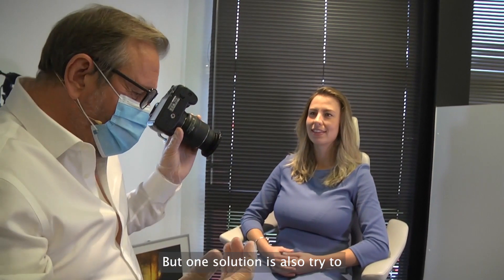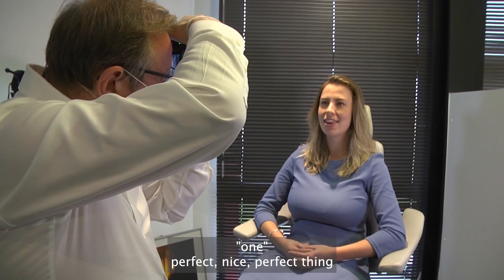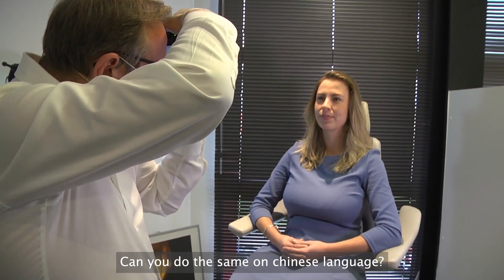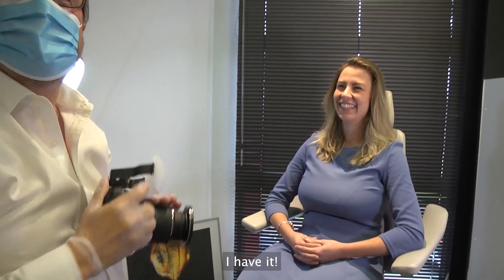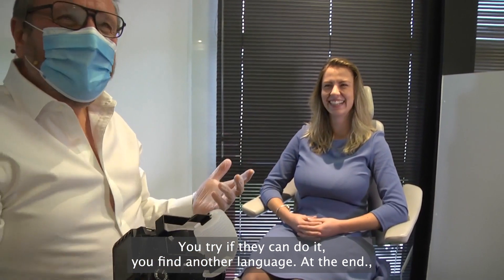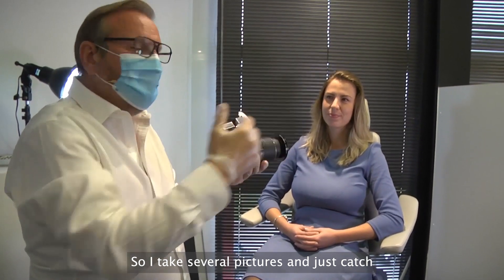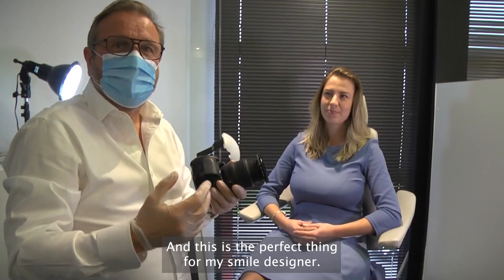One solution is also to try to count down from nine to one. Can you do the same in the Chinese language? If they can't do it, you find another language. At the end, you have a smile, and I have to catch a real smile. So I take several pictures, and I catch not the biggest smile, but the smile at the good area — and this is the perfect thing for my smile designer.